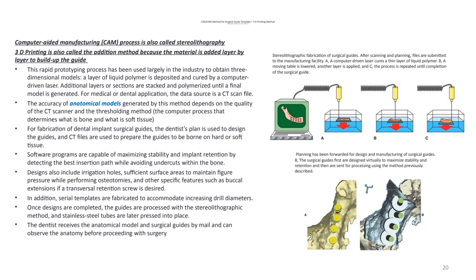It could be that the tissue is very thick. So there are certain clinical aspects that we don't see that the doctor sees. So this approval of the design is very important, first of all for placing the implant in the correct position, and also for fabricating a restoration that is going to be functional.